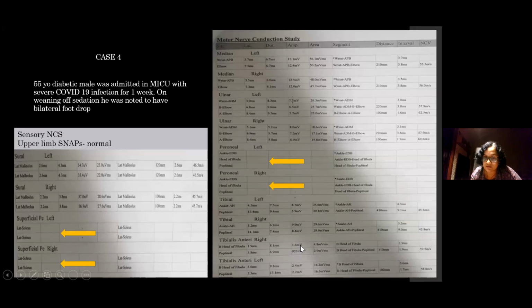you can see actually that there is a reduction in the amplitudes in the CMAPs recording from tibialis anterior, a possible conduction block at this level, though you can't really be sure whether that's genuine because it's such small, less than 1 millivolt. Remember, to measure conduction block, it needs to be at least 1 millivolt, the distal amplitude, and you anyway don't have any slowing in conduction velocity across the popliteal fossa, so difficult to say that.